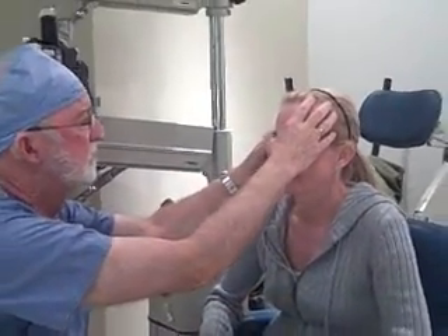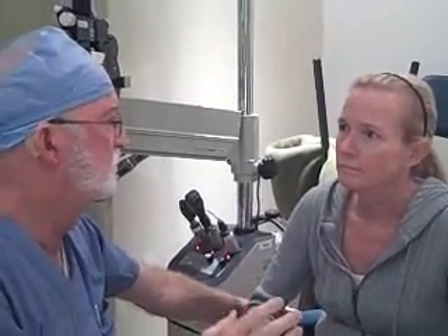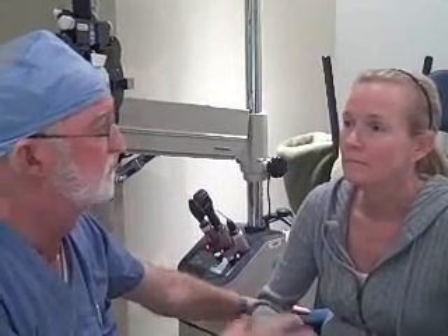Close your eye — it's going to feel like I'm pushing on your eye with my thumb, like that. And it's only going to be for about 20 seconds. During that 20 seconds, you don't want to move, you don't want to talk, you keep breathing. And we'll count it off — 20, 15, 10 — until it's finished.